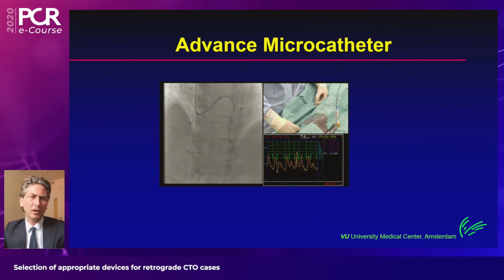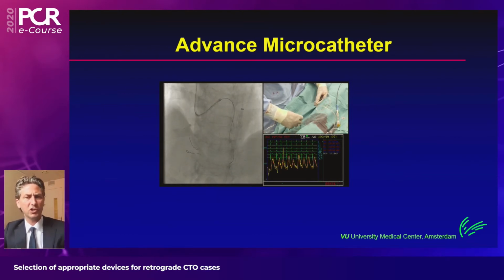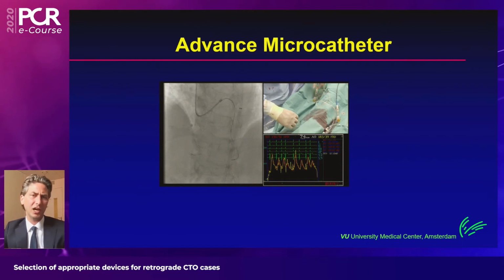And you can see that the Corsair Pro right now is stuck at the base of the heart between the junction of the septal and the PD, but it's often just about building up torque and tension and waiting a little and giving it time.